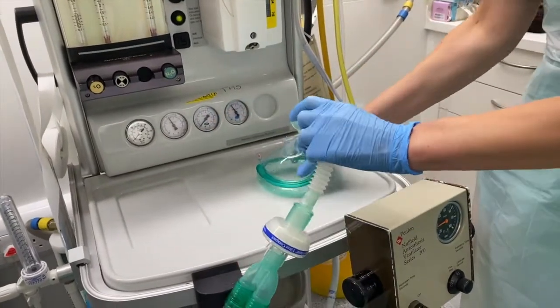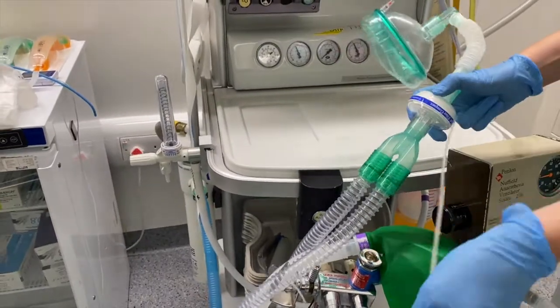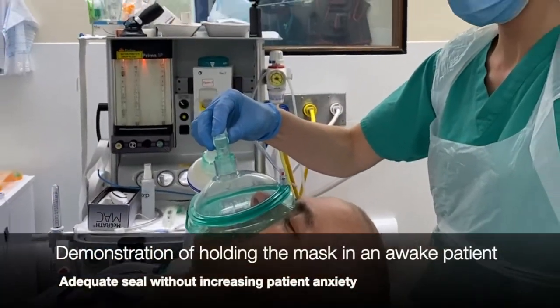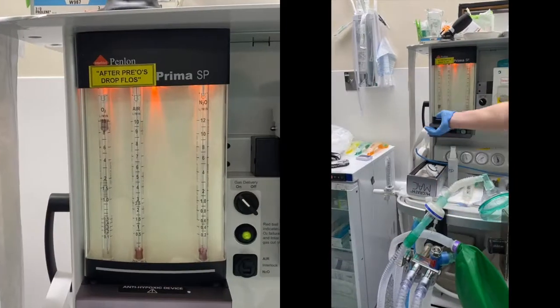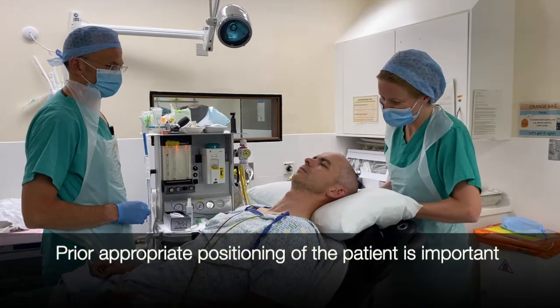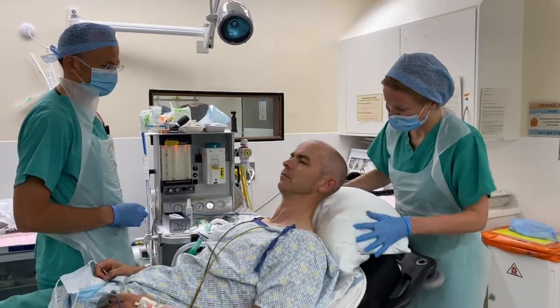Pre-oxygenation. Assemble the face mask, HME filter, and circuit. Attach the capnography sampling line to the assembled circuit. Ensure that the initial movements in positioning and holding the mask are gentle to minimize patient anxiety. Turn on the oxygen to 6 to 8 liters per minute. Gently place the mask on the patient's face, ensuring comfort and avoiding compression of the eyes and soft tissues.